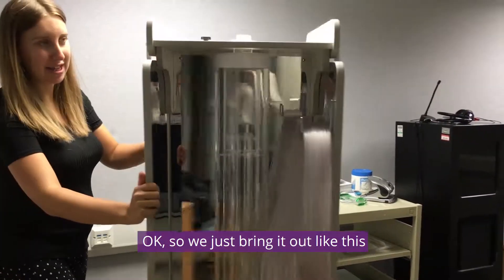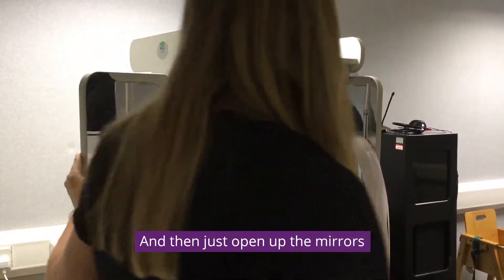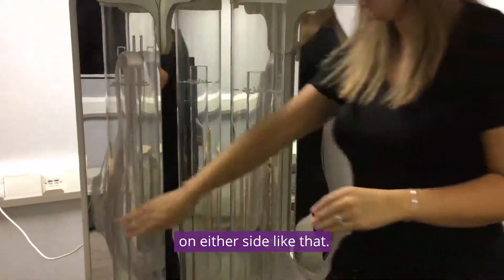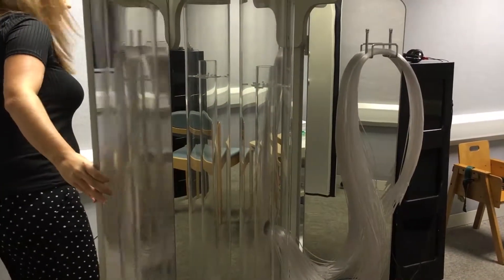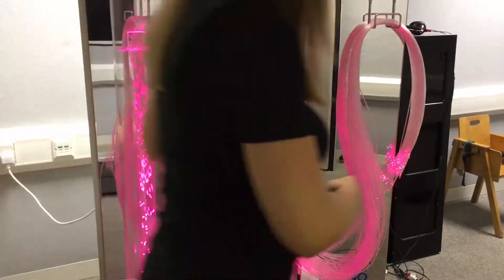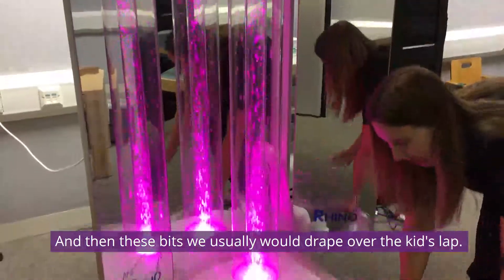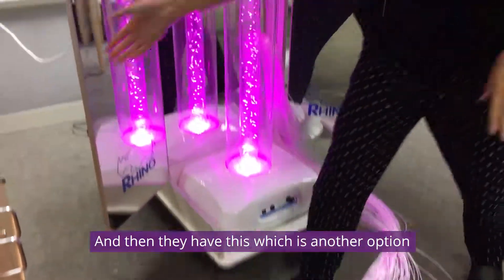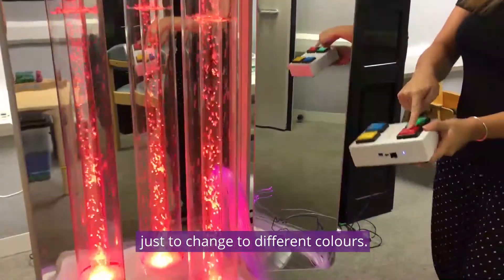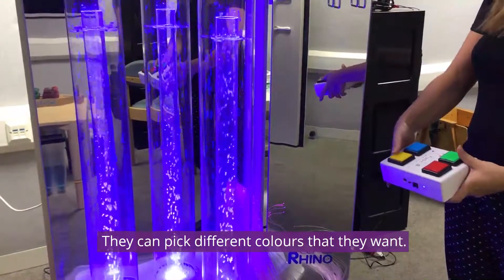We'll just bring it out like this, and then just open up the mirrors on either side, just like that, and switch it on. These bits we usually would drape over the kids' lap. And then we have this, which is another option just to change to different colours, so they can pick different colours that they want.